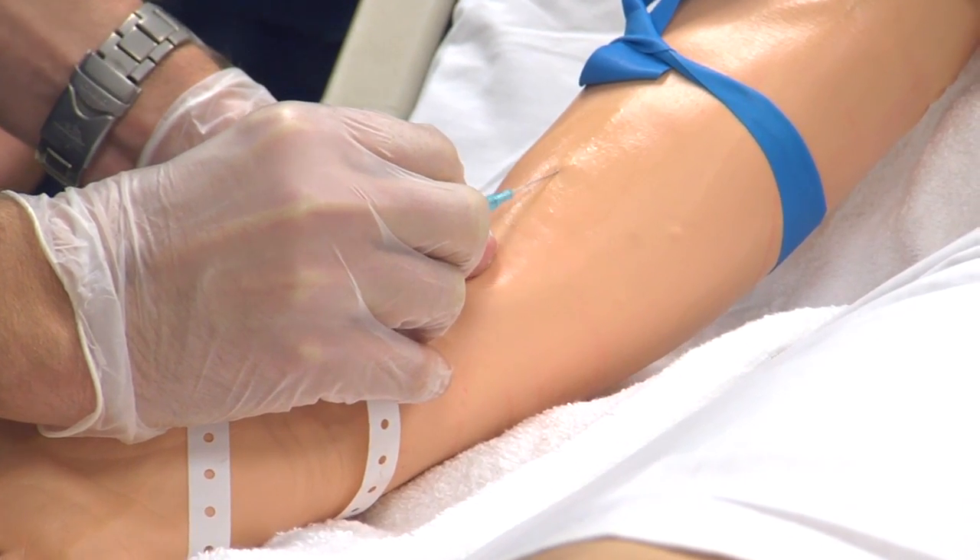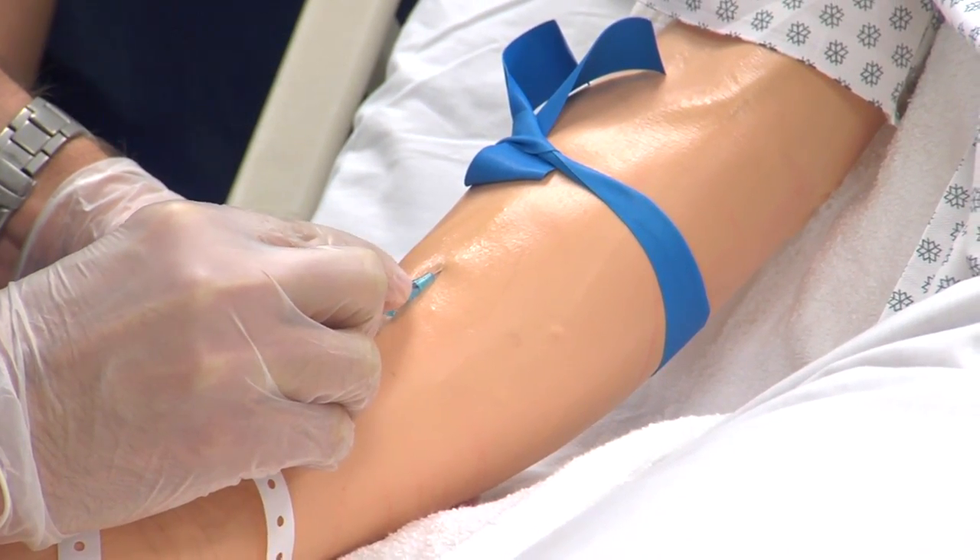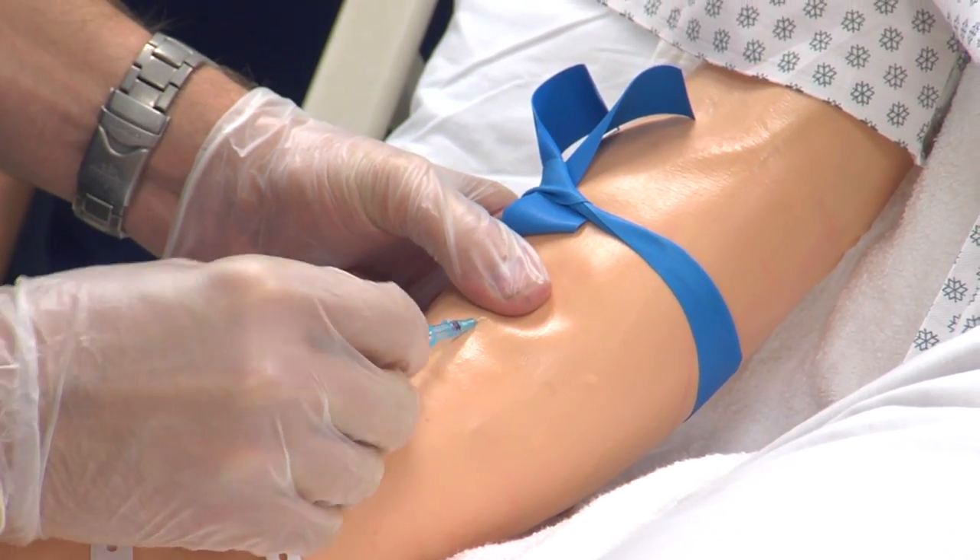He's going to insert it bevel up at about a 10 to 15 degree angle above the skin. And once he sees that flash come back into there, he's going to advance the catheter in.